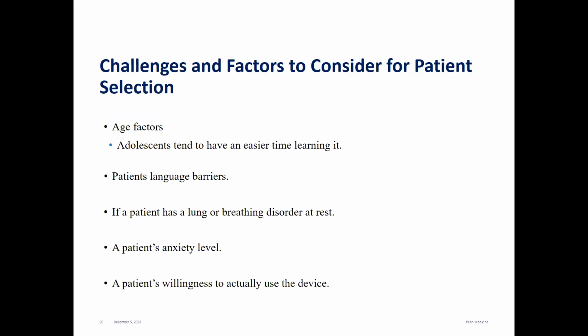If the patient has a lung or breathing disorder at rest, this should also be considered because they probably can't do it. A patient's anxiety level and willingness to actually use the device. Some patients might be good at it, but they might not want that added stressor during treatment, or they might not want to continue to use it for every treatment.